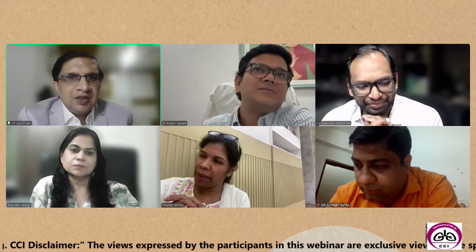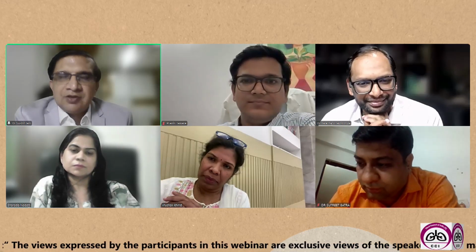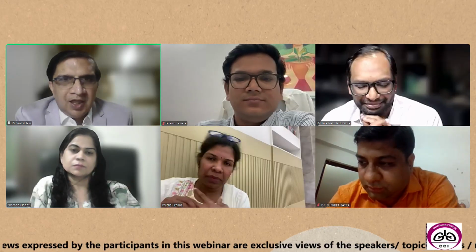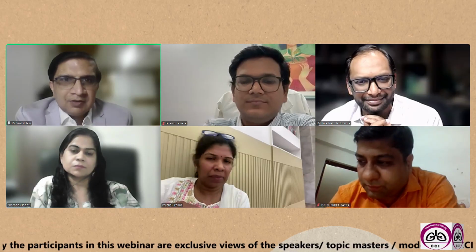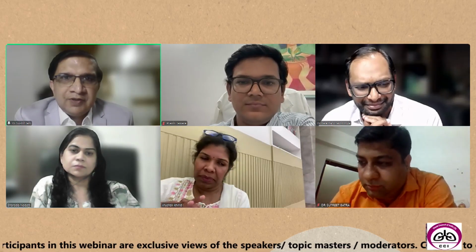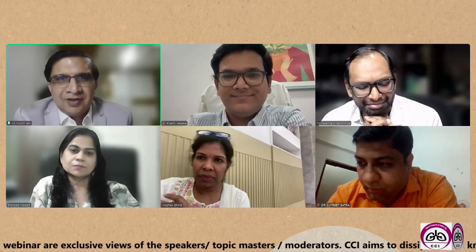Yes, true. And I think when you call up the pathologist and tell the pathologist, their interest also improves, the communication improves, and probably the outcome improves. That's what I always feel. So I make sure I always communicate with the radiologist before the procedure and with the pathologist after the procedure if you're not doing a ROSE. So that's an important message that communication is an essential part of our procedure. So we need to make sure we communicate well with the pathologist, and that makes a lot of sense.